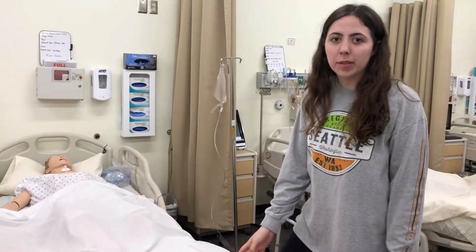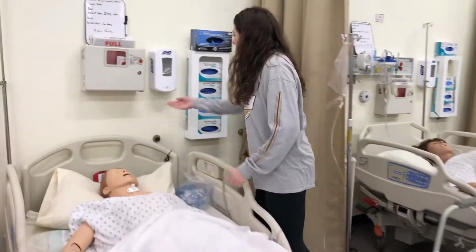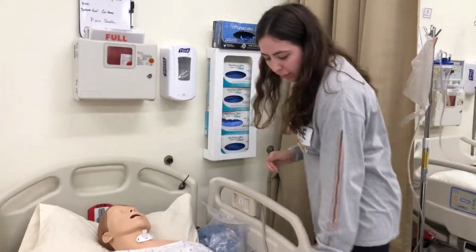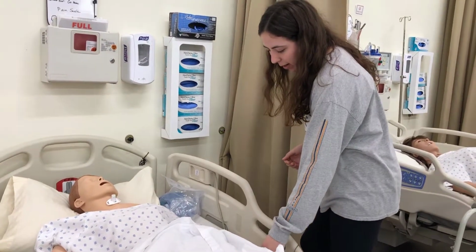Okay, so now I'm just going to walk into the patient's room and explain the procedure. Hi, how are you? My name is Courtney. I'll be your student nurse today. Could you please tell me your name and date of birth? Courtney Benoit, 5/29/98.